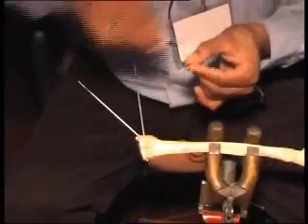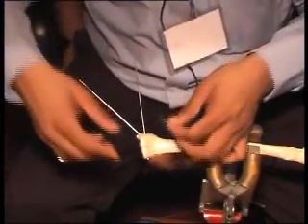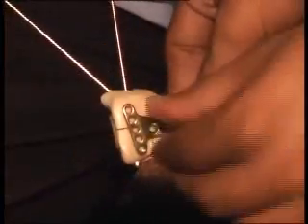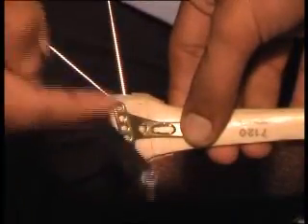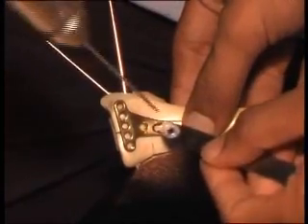The contouring was already done — this plate was used earlier, so the bending from lateral and medial was pre-formed. On the volar surface, all the flexor tendons, especially the FPL, are just gliding over the plate, so contouring is important. We use a normal sleeve, which is a non-threaded sleeve. We first use a cortical screw on the plate in the center of the oblong hole, so that we can slide the plate distally or proximally as needed.